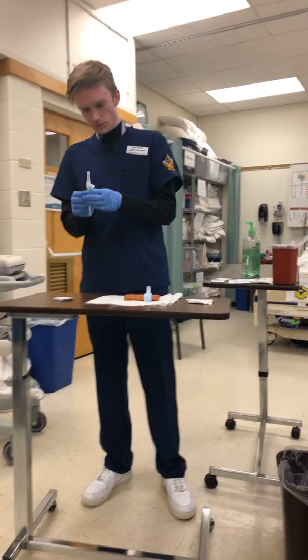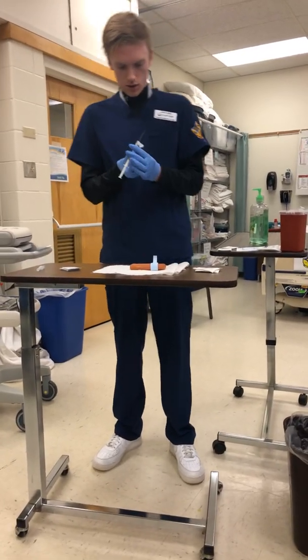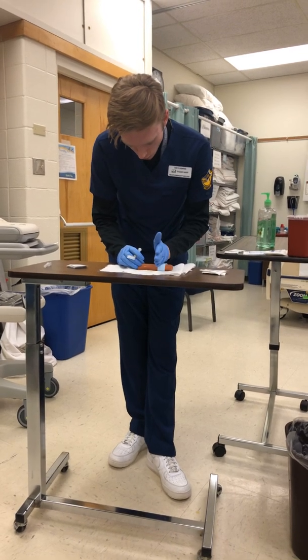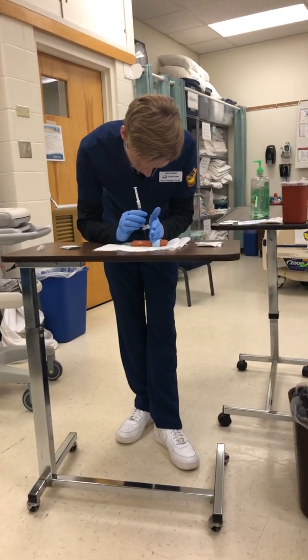So now we are good to administer the medication. And then you'd use your hand and pull up slightly, and then identify your site once again with bevel up facing the hip, and then straight in.